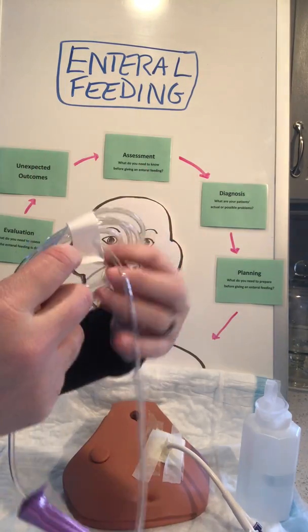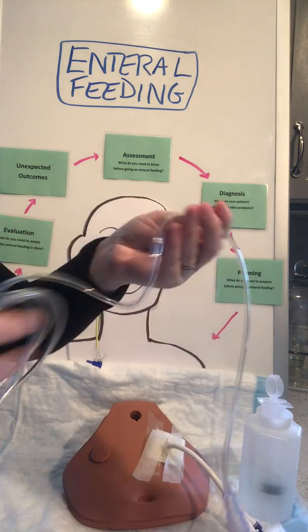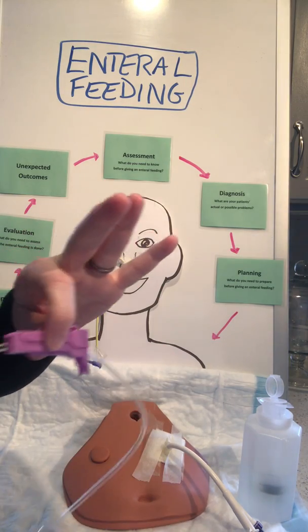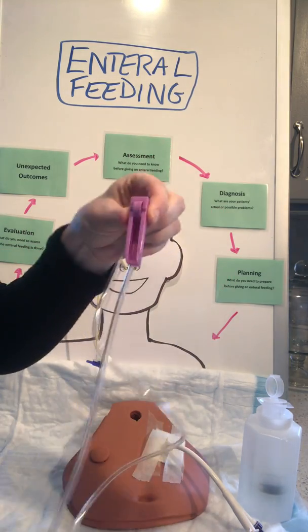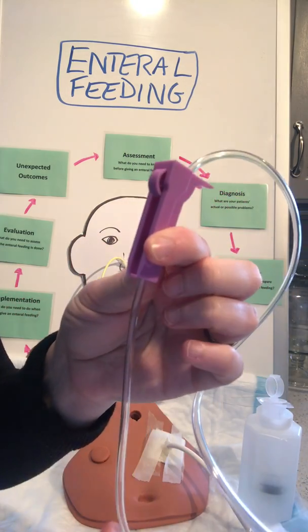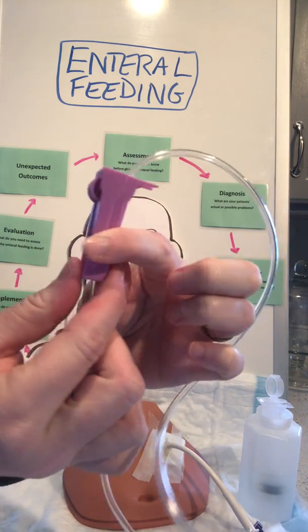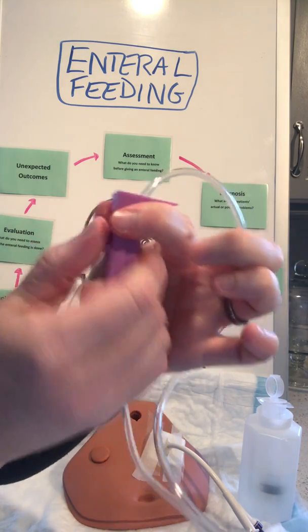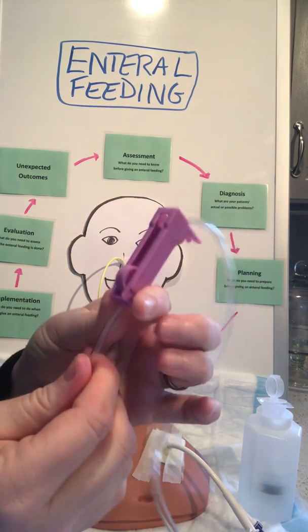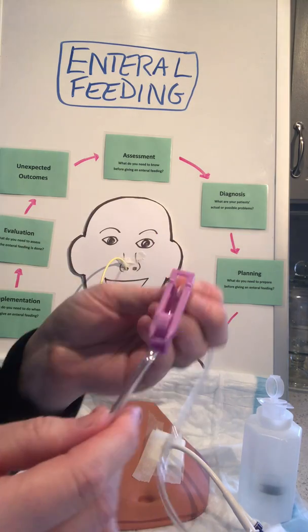And sorry, when you get these out of the bag, there's always some kind of paper thing holding it together. You can take that out and straighten your tubing out. But on your tubing, for tube feeding and in the future for IV tubing, there's always this roller clamp. And the roller clamp is how you adjust whether anything's flowing through the tube or not. So if we roll the clamp all the way down to the narrow part, I'll roll it down with my thumb, that closes or clamps it. If I roll it back up, that opens this tube and stuff will flow freely through it.